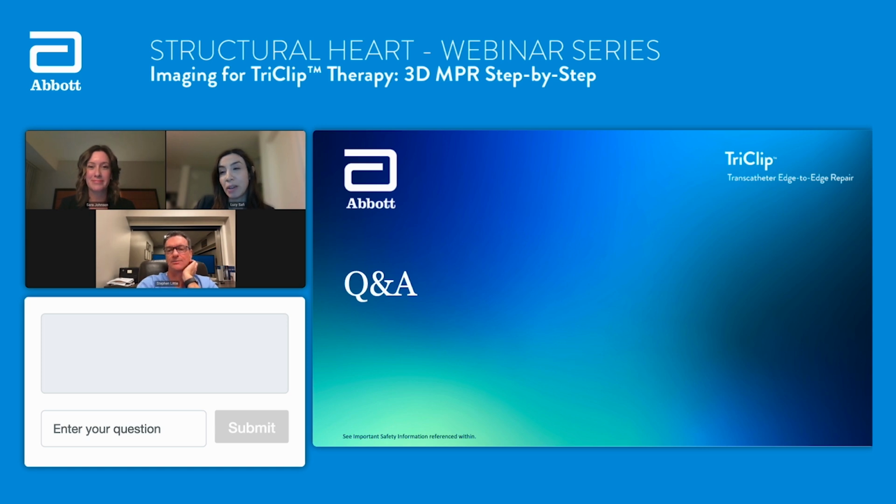What I usually tell people who are getting started with MPR is to practice on normals. Practice when you have time in the echo lab. As Dr. Little mentioned previously, you don't want to walk into a TriClip procedure and try it for the first time. It does take time and practice. But if you look at my videos, building the MPR doesn't take more than 20 seconds. You can get really fast at it, but I would say practice in the echo lab. You can practice offline and practice on normals.